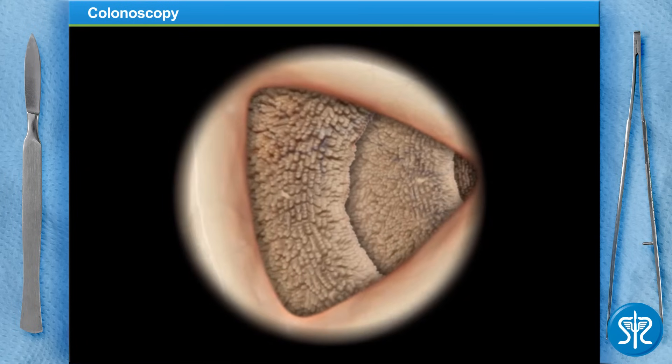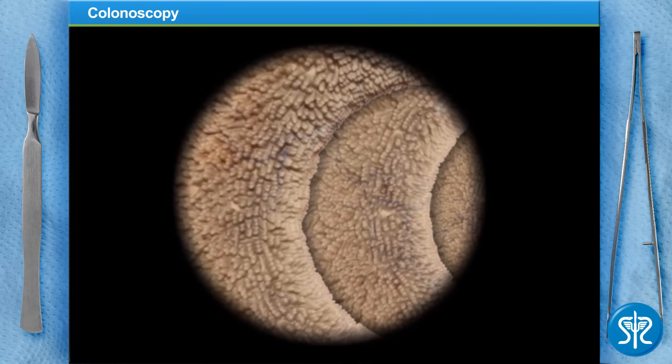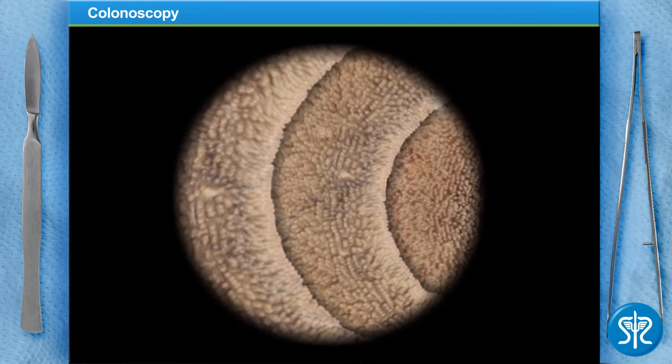Back in the ascending colon now, we move into the cecum and all looks good. Let's take out the scope and get our patient into a recovery room.